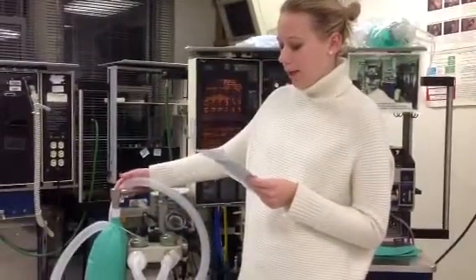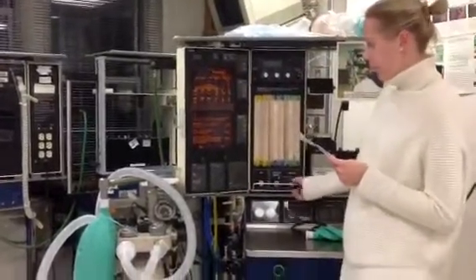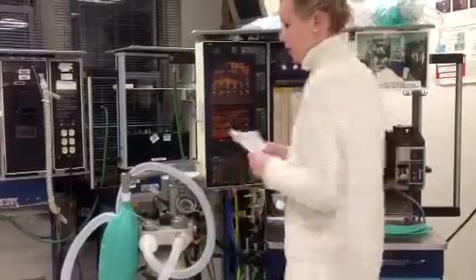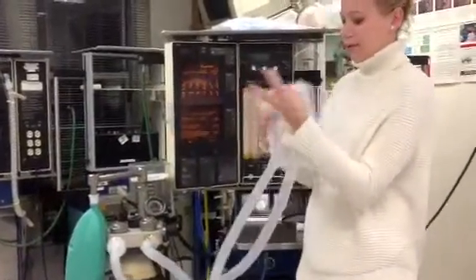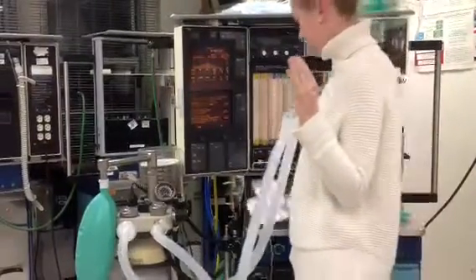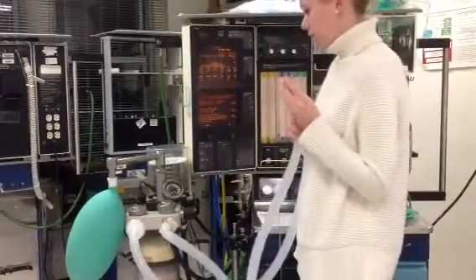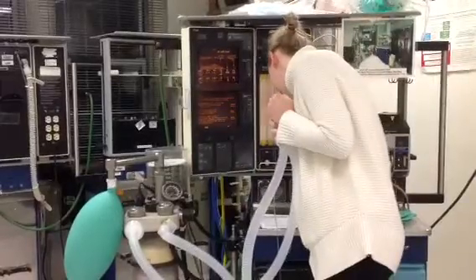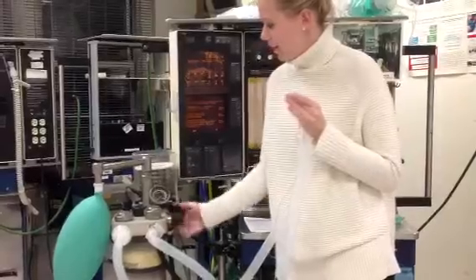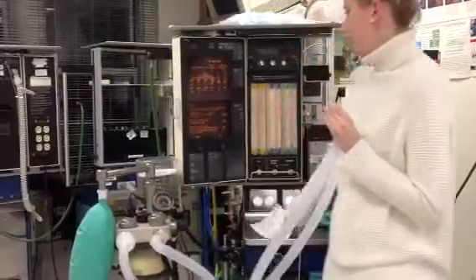So then perform the leak check of the breathing system, set all gas flows to 0, close the APL, righty-tighty, occlude the Y piece here, and pressurize the breathing system to 30 centimeters of water. This should go up to 30, and make sure that stays for 10 seconds. Open the APL valve, and make sure this fully distends without any problems.